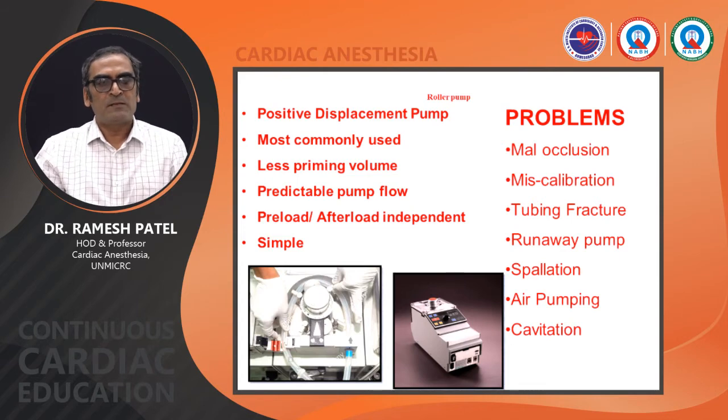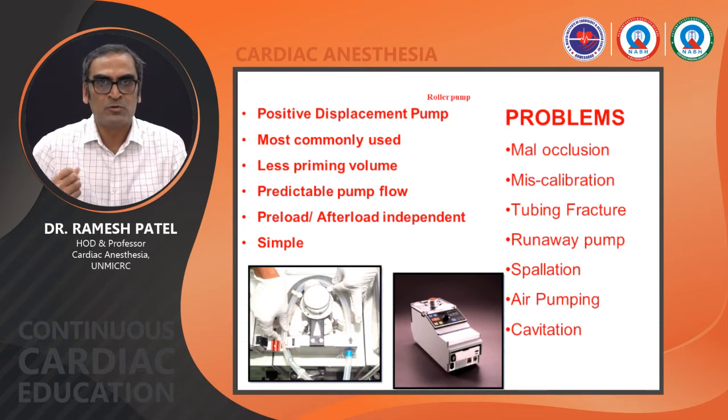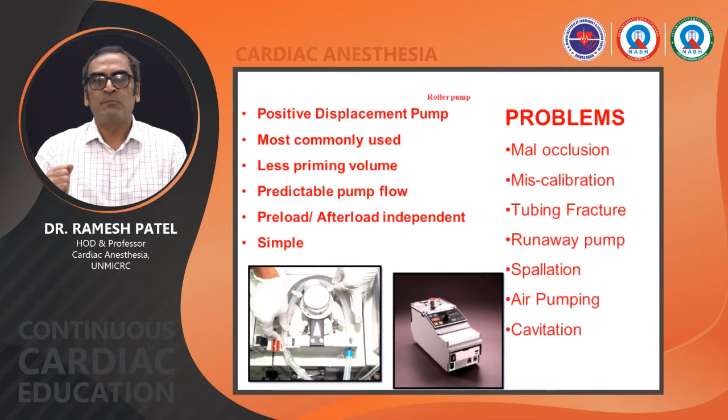The roller pump is a positive displacement pump, and it is most commonly used. It is independent of preload as well as afterload, so we can give the flow as per patient requirement and clinical use. But problems with roller pumps are malocclusion, miscalibration, tubing fracture, runaway pump, spallation, and of course sometimes air pumping.